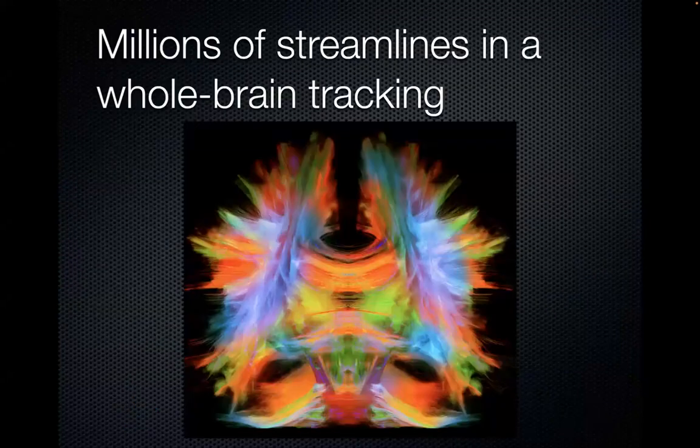And so using your crossing fibers, using your masks and your seeds, you're able to reconstruct millions of lines in about 10 minutes. So quite fast. And of course, if you follow my recommendation, the quality of this tractogram will be better than if you use DTI.